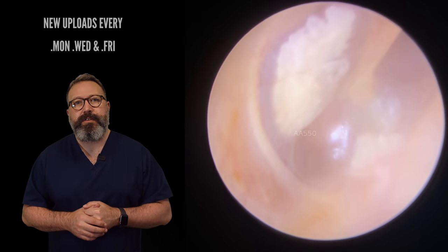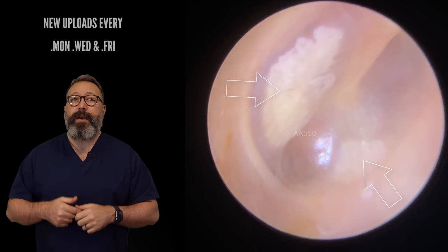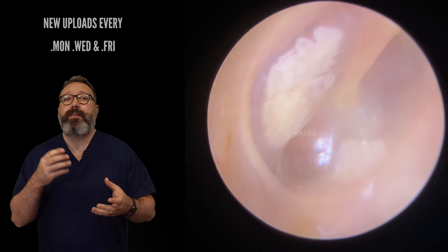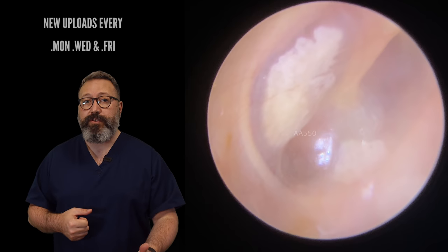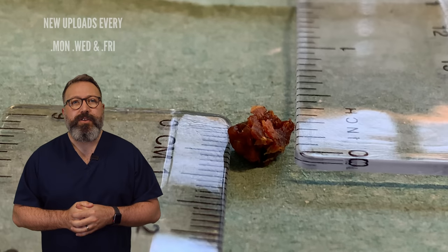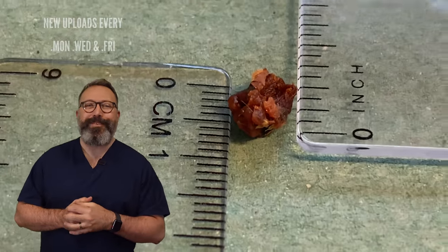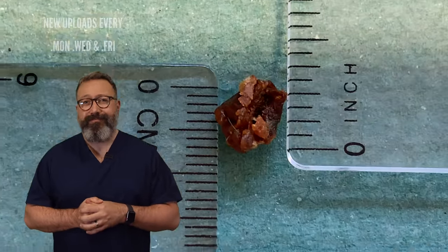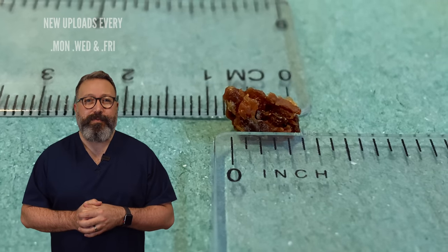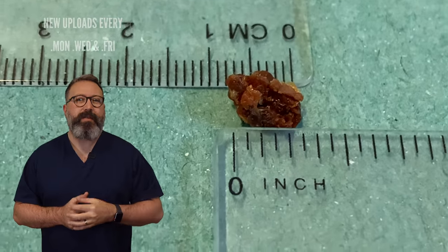Now this patient has some scarring. This patient has suffered with infections and they had grommets fitted. Those two white patches I'm pointing out there are actually scar tissue left behind — probably a little bit from the grommet and a little bit from the infections the patient was having as well. So it's almost a thickening of the eardrum there. This is the piece of wax that we removed — about a quarter of an inch, just under a centimetre. Quite a big and quite a hard old piece of wax that one as well.